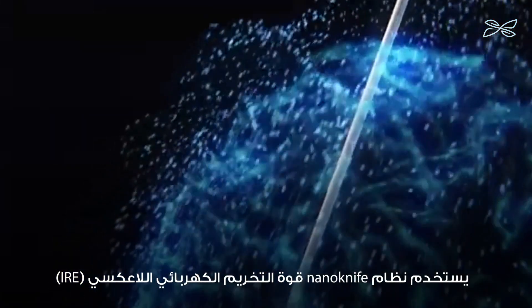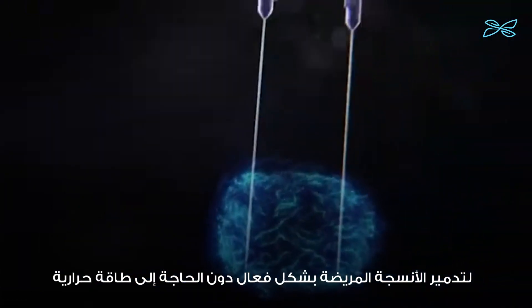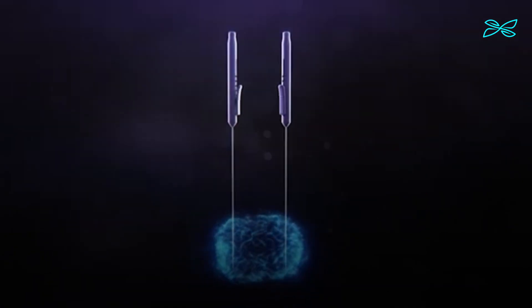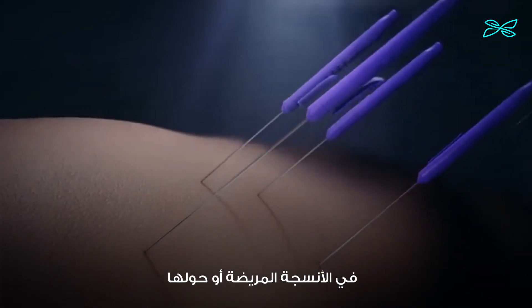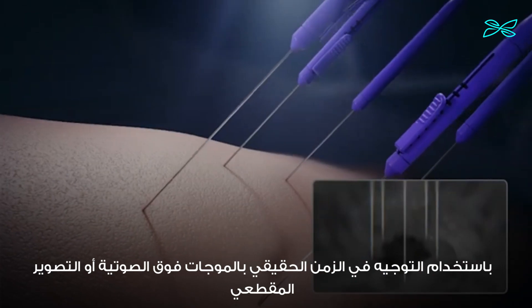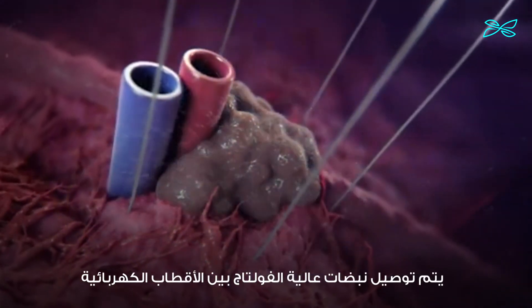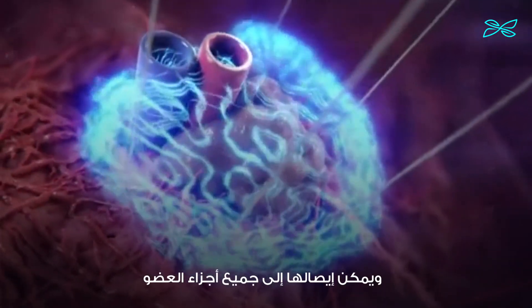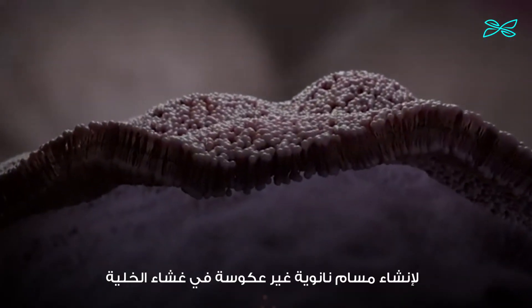The NanoKnife system harnesses the power of irreversible electroporation (IRE) to effectively destroy diseased tissue without the need for thermal energy. Two or more minimally invasive needle electrodes are positioned in or around the diseased tissue using real-time ultrasound guidance or CT. High voltage pulses are delivered between the electrodes and can be confidently delivered in all segments of an organ.